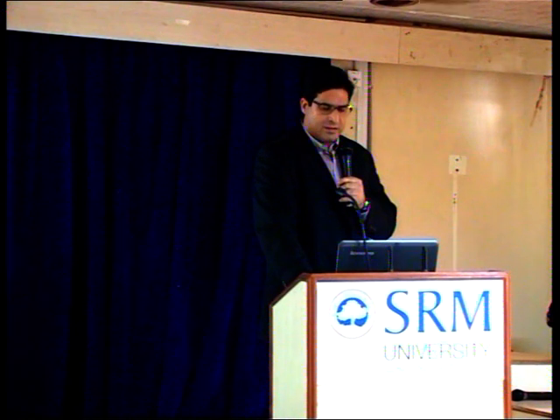Now I have ultrasound equipment, the cost of which is 2 lakhs. And I have ultrasound equipment, the cost of which is probably 60 lakhs or 1 crore. What is the difference between the two? I can see the kidney with the 2 lakh product also, I can see the same kidney with the 1 crore equipment. But the final details which I see here and what I see there may be entirely different.